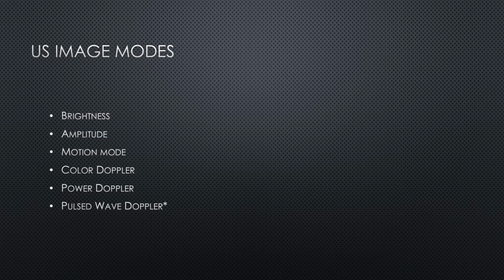The spectral Doppler, which is like quantitative Doppler. There's pulse wave Doppler, which shows quantitative movement towards or away from the transducer at a gated location. It is known to increase heat energy transmitted to the interrogated structure, so it's not supposed to be used in, for example, first trimester OB scans or anytime you don't want to heat whatever tissue you are interrogating. And then continuous Doppler shows movement in an interrogated plane.